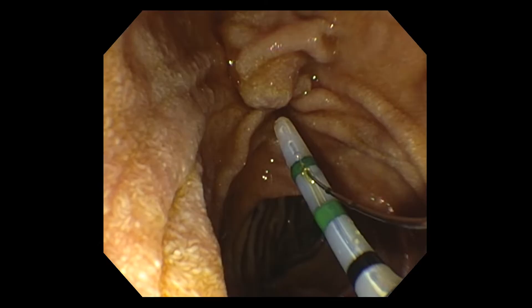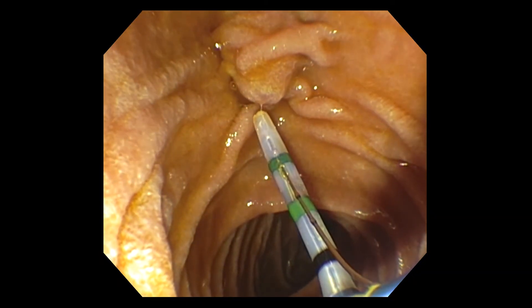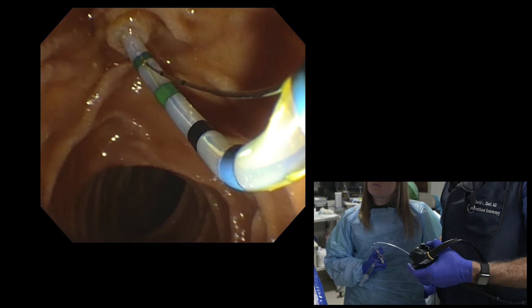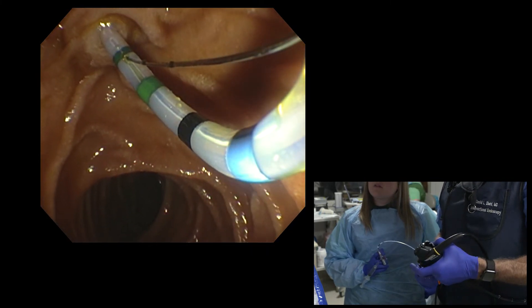With the advent of improved sphincterotomes with excellent bowing and good orientation, there's more of an advantage to use a sphincterotome to accomplish cannulation. For example, the sphincterotome can be bowed to achieve the optimal angle of approach to the papilla. A close relationship is necessary between the endoscopist and the assistant to optimize the approach.